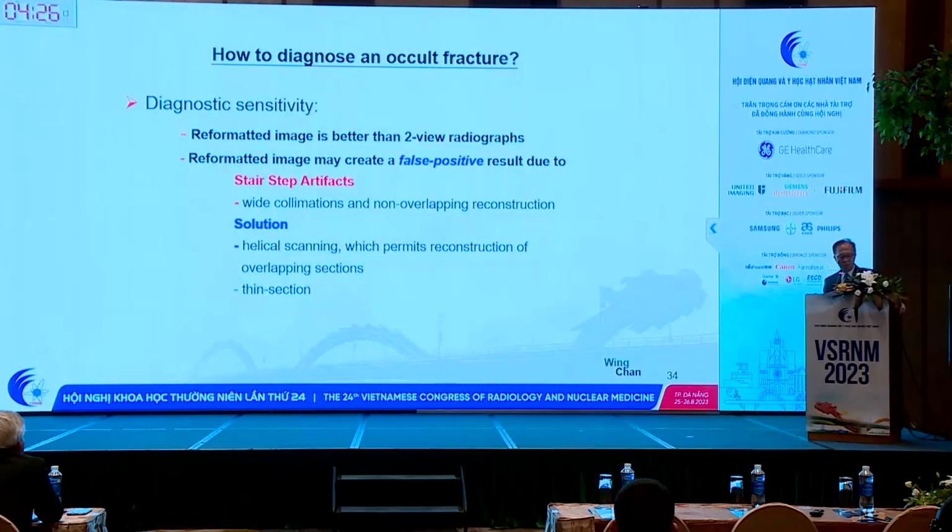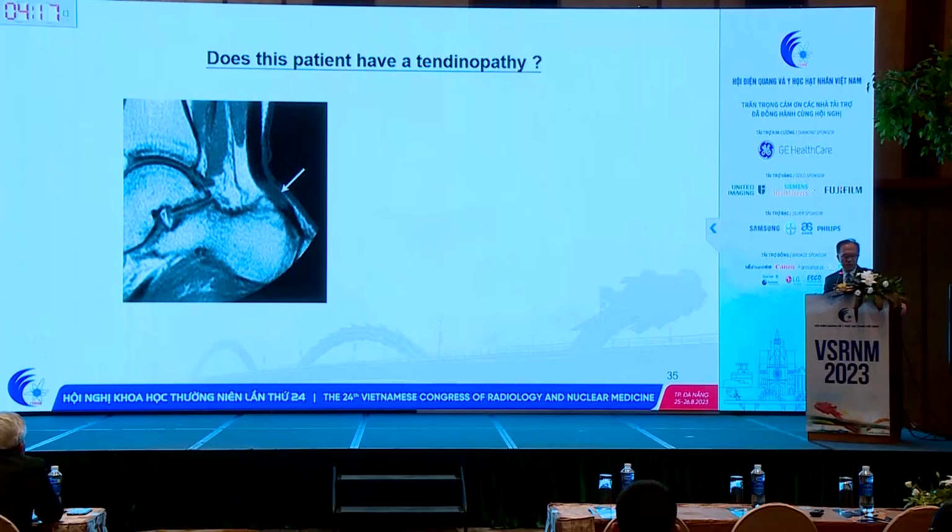I think here everywhere is overlapping, everywhere is helical CT scan. We don't need to worry about it, even for 64-slice CT scan.